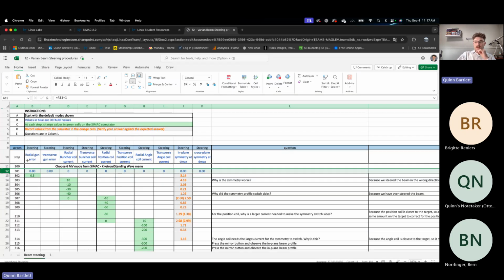So then it tells you which screen to go to here. You can see these are all in the steering screen that we're investigating. And then it asks you, at each step, to change values in the green cells on the Simac simulator. So that's when it wants you to add a 0.5 to the radial gun error, basically what we just did. And then we look at the in-plane symmetry at D max, which is going to be 3.14.